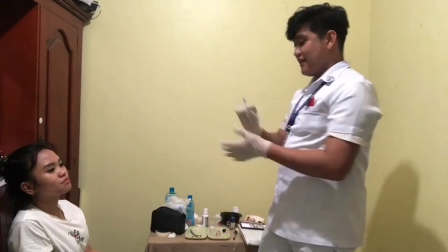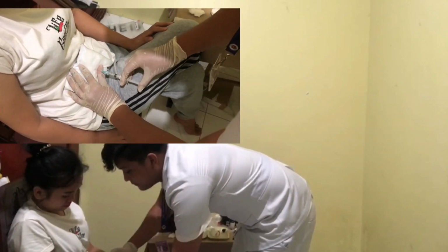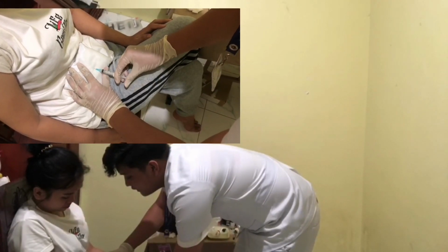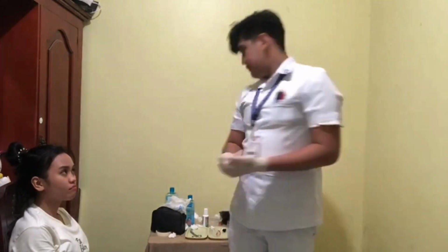Okay, now I am going to perform, ma'am. I'm going to pinch and then release, and there you go. And then discard. If blood appears, make sure to apply gentle pressure using a gauze pad until it stops.